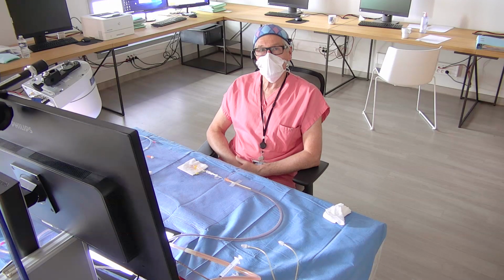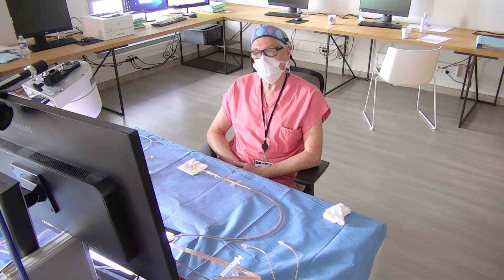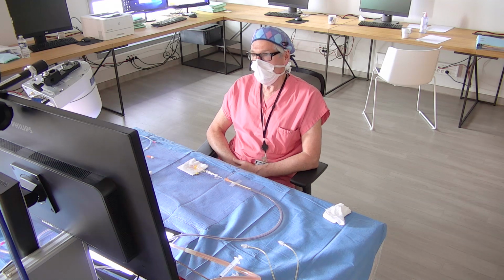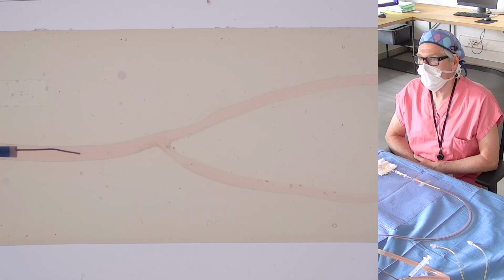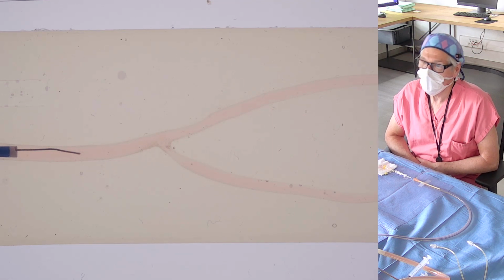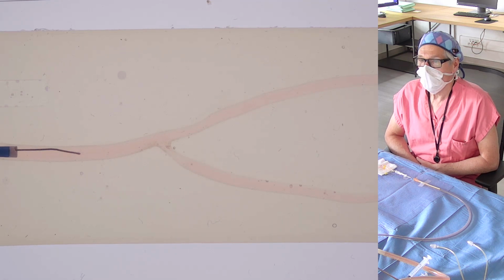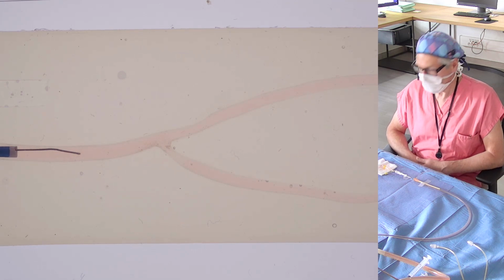Thierry. So we'll try to simulate what we have done in the patient, in the bench, with the help of the Terumo team, who built a very nice bench for simulating bifurcation treatment in a silicone model. The anatomy is very close to what we have done just before, with LAD, which is a little bit bigger, 2.5, and diagonal branch, which is 2.25, and the proximal is 3.0. You can see that there is some stenosis, but which are not very severe.